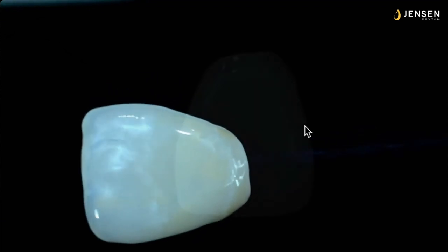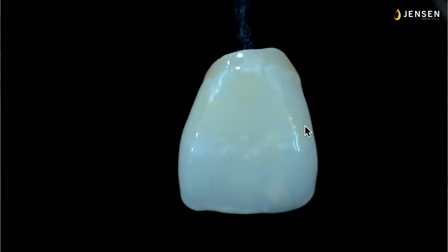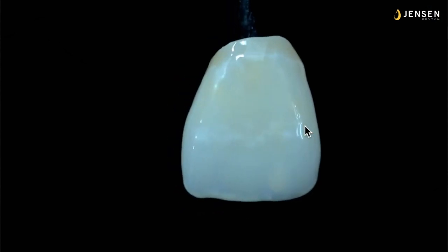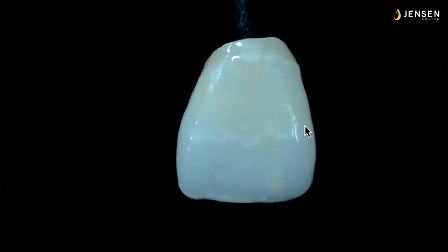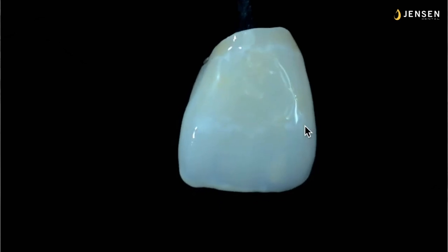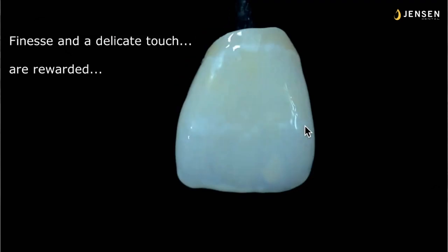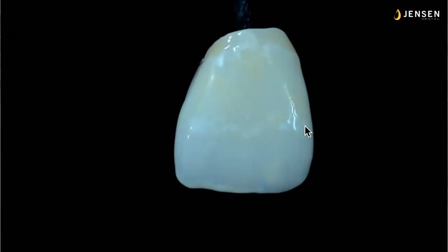So we'll get a little bit different angle of the light so you can see. You can notice the halo effect, the translucent window, the lobes, the mamelon color there, hypocalcification, and a root section. To do this from start to finish, if your colors are laid out, is about a 2 to 3 minute process, depending upon how much you're putting into it. But very, very quick, and the nice thing is, it's WYSIWYG. What you see is what you get.